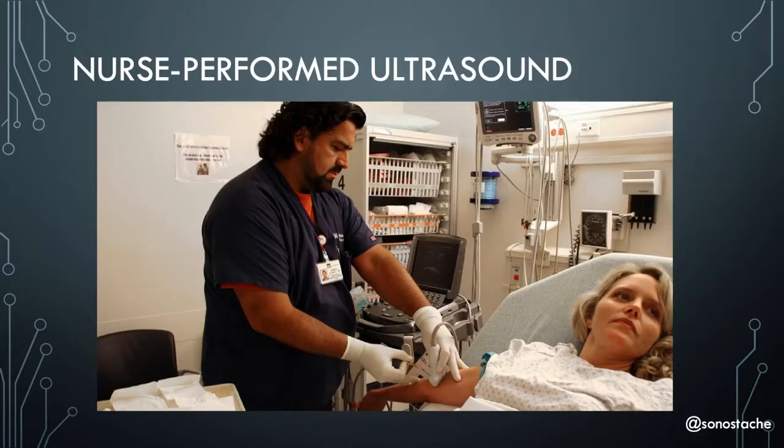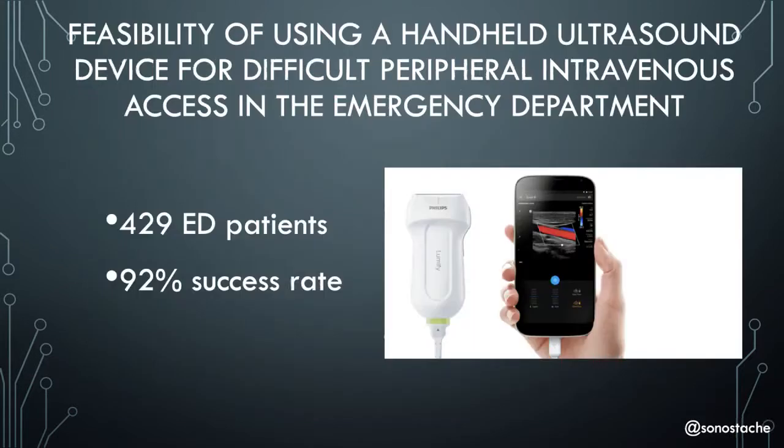So now nurses. There's a lot of literature published, even in the handheld ultrasound world. They're not only putting in IVs, they're looking at the B lines and so on. Actually, in the Banner healthcare system, RTs perform ultrasound, and somewhere in Phoenix in a bunker, physicians are watching them perform the ultrasound and giving instructions whether they need to give fluid or not based on the B lines. So because of the simplicity of handheld ultrasound, RTs or nurses or somebody who doesn't have the same background like us could still use it.